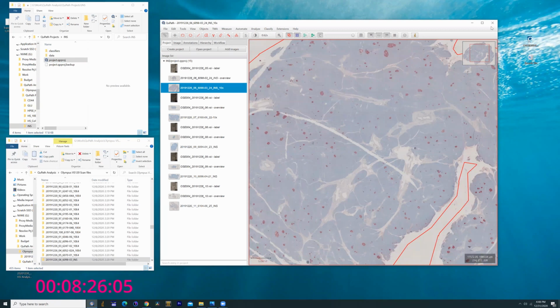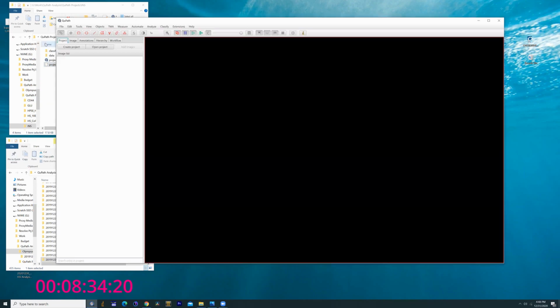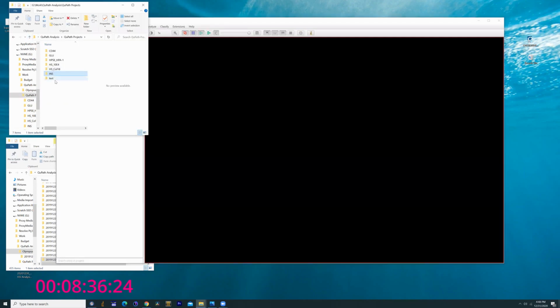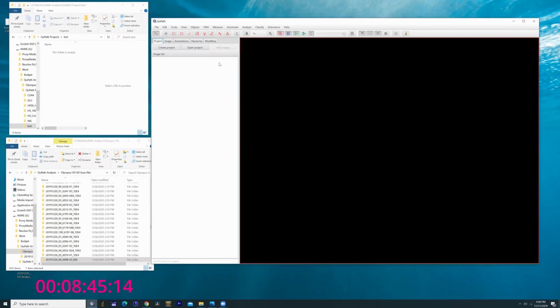Now, with that being said, let's start over. I'm going to start fresh. We're going to open a new database. And we're going to store it, in this case, just because I want to run a dry run here. We're going to put a new database, create a new project.